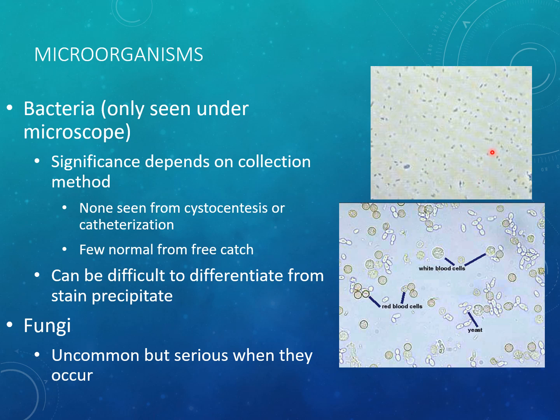We can see bacteria are really small. They're going to be either rods or cocci, or chains of rods or cocci, where cocci are the little spheres. So chains of spheres or rods, depending on the species. We report bacteria, again, by how many we see per high power field. If there's so many, it's kind of like red blood cells, we say too numerous to count.